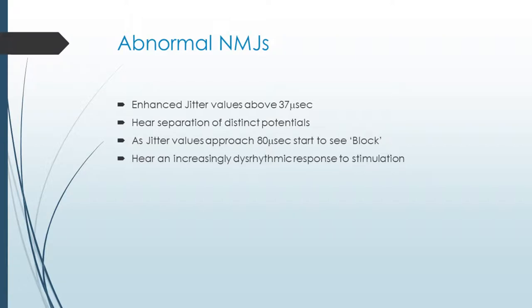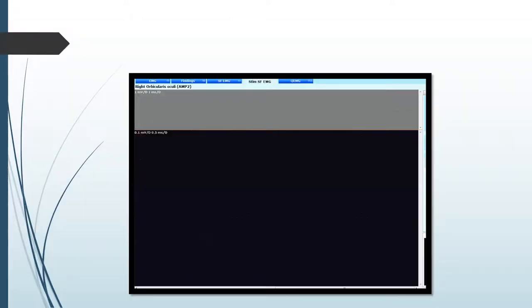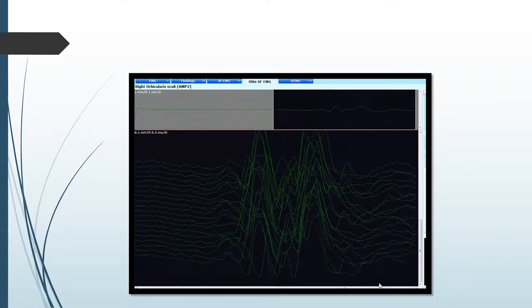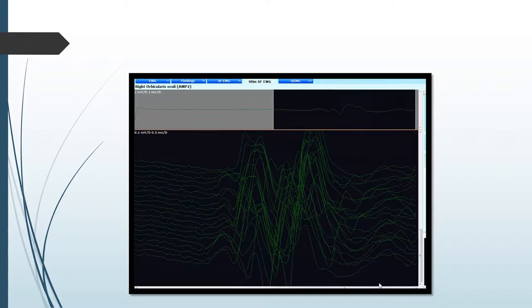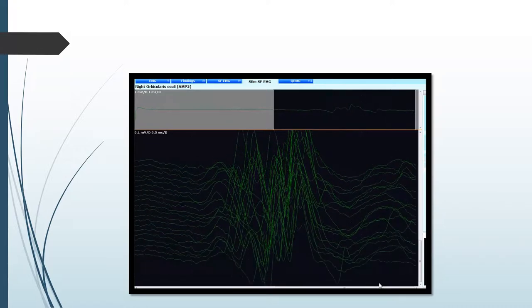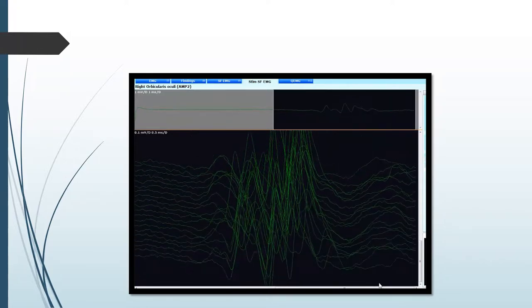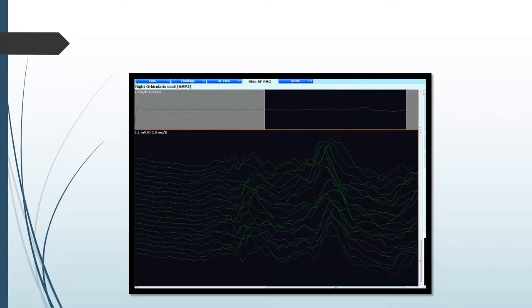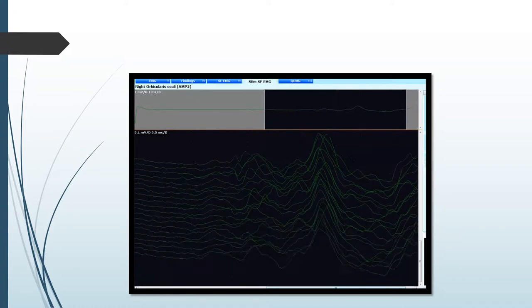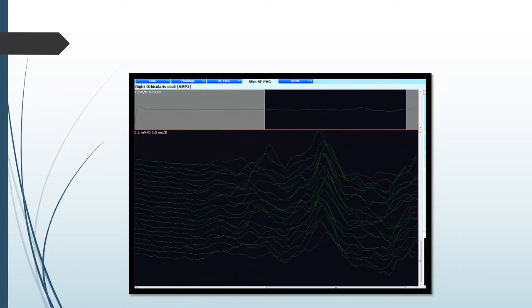You can see in the screen the stimulation spike, and you can see very clearly if we start by looking at the top tracing that all these stimulated potentials are jittering all over the place, and then if you focus down on the main window here, you can see that very clearly. I'm now going to focus in on a single one of these stimulated potentials, and you'll be able to see very clearly how it's jittering away, and you can really hear its dysrhythmic nature.